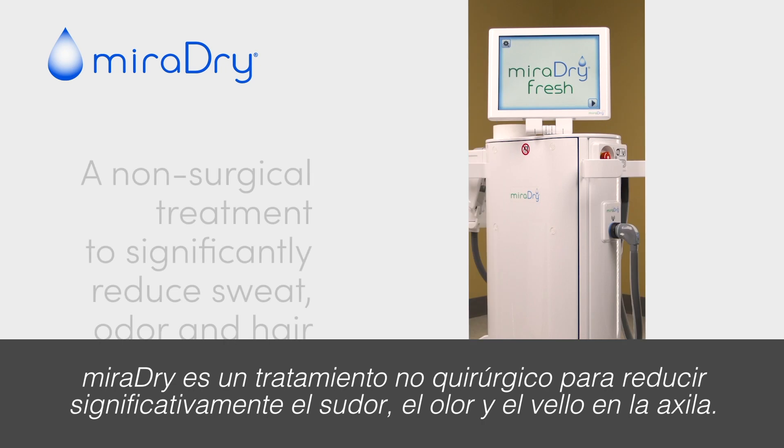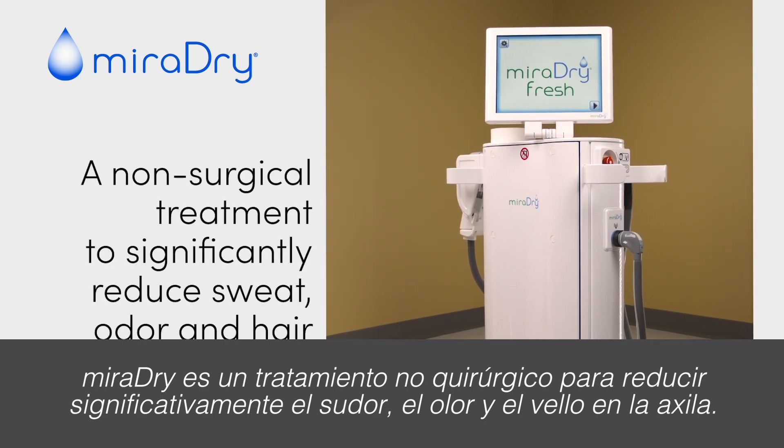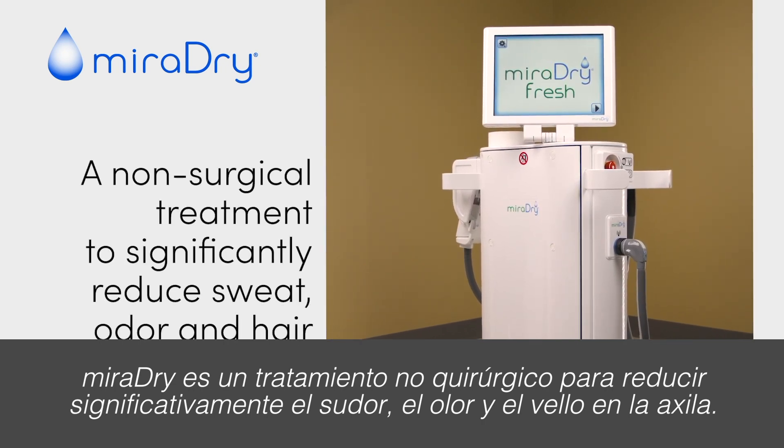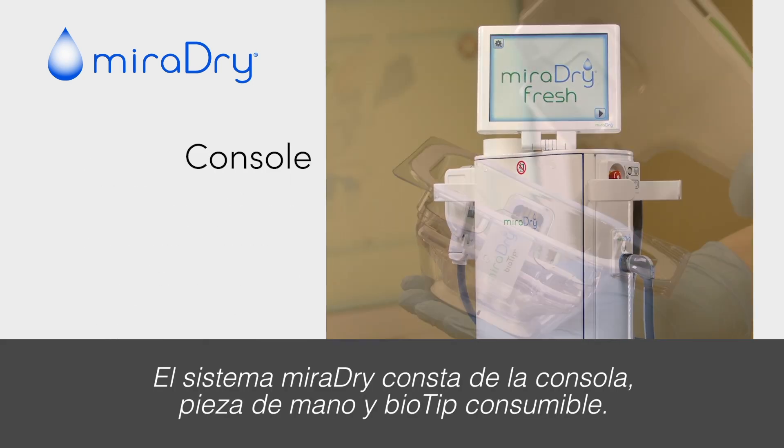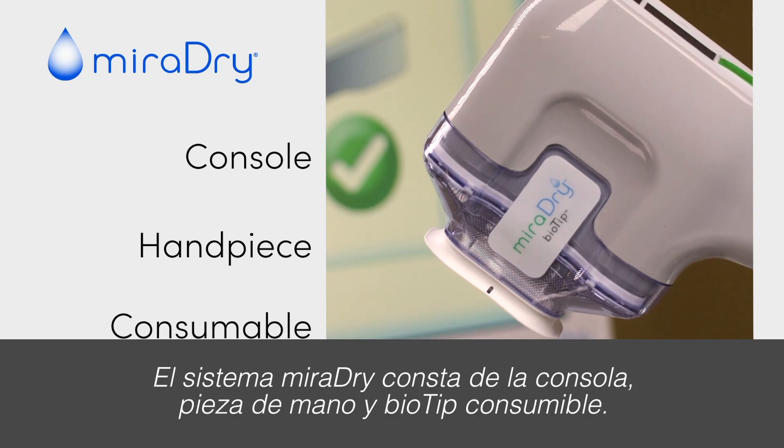Miradry is a non-surgical treatment to significantly reduce sweat, odor, and hair in the underarm. The Miradry system consists of the console, handpiece, and consumable biotip.